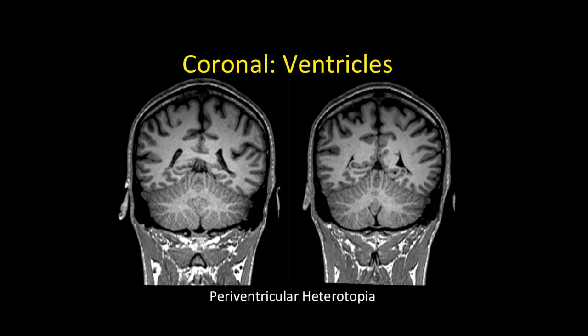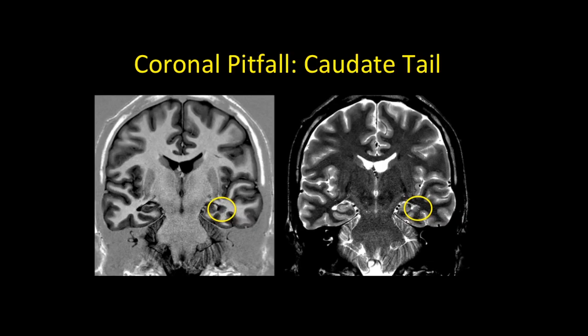Continuing with the coronal, after looking at the poles, look at the ventricles for heterotopias. These will be T1 iso-intensity cortex lining the ventricles — they're often missed in the occipital horns and temporal horns. Here's a good case. A key pitfall: the caudate tail is a normal structure lining the temporal horn that can be mistaken for heterotopia. Caudate tails are bilateral, symmetric, and present in every person — don't over-call them. The heterotopia has a distinctly different appearance.